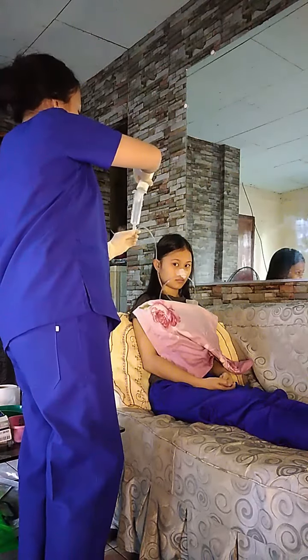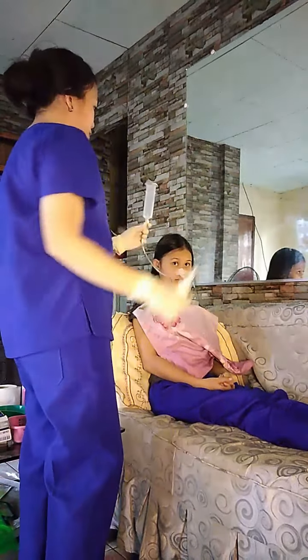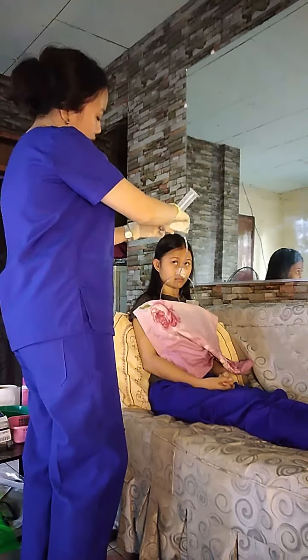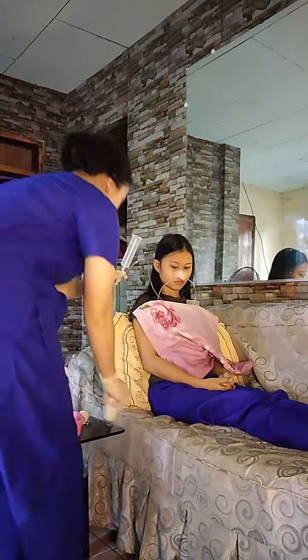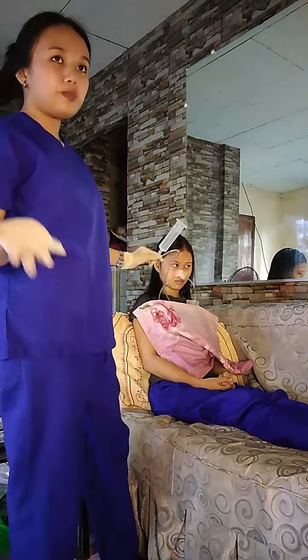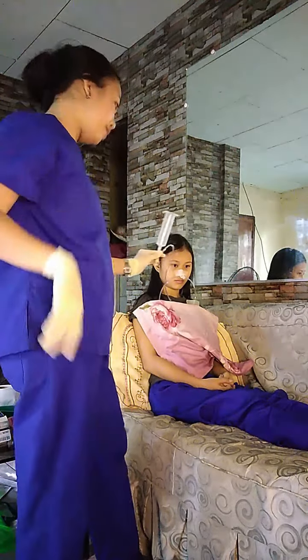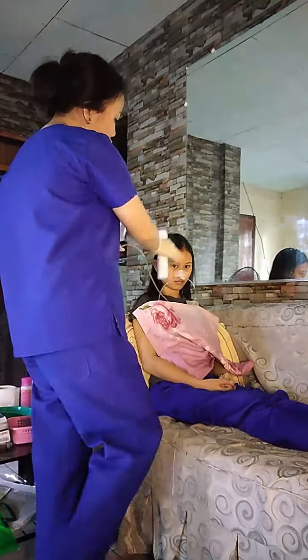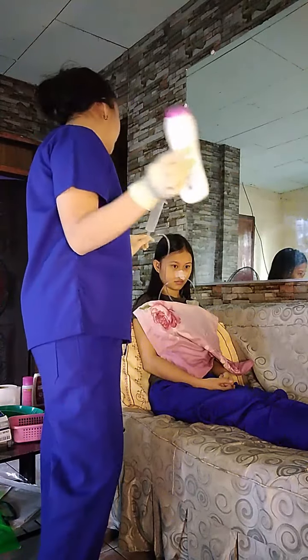So, ayan. I-let go ko na habang inubuhos ko. Assuming na inubos ko na siya. And then, habang hindi pa siya nade-drain, i-estimate na natin na i-clamp na natin siya agad para ma-prevent natin yung air na makapasok sa stomach ng patient. So, pagkatapos ma-flush ng tubing, i-administer na natin yung feeding.